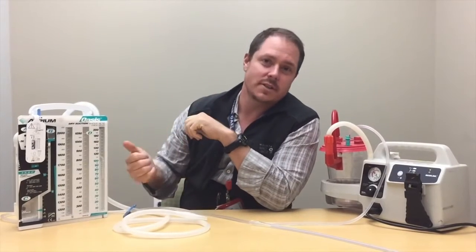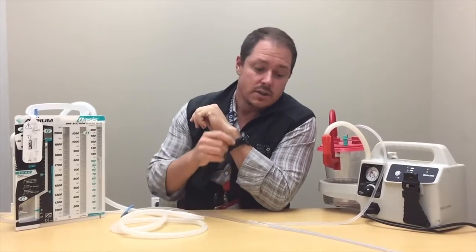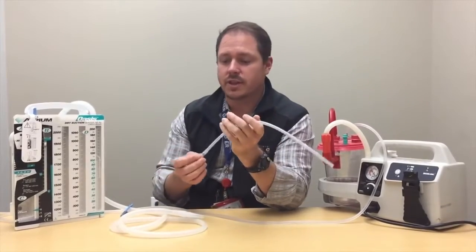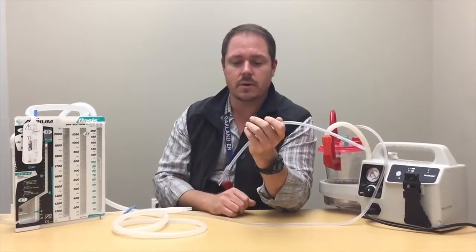This is a quick introduction to the OASIS dry suction system used at Kaiser Oakland and Richmond Emergency Departments. Nurses who don't work in trauma centers aren't necessarily familiar with placement of chest tubes with physician counterparts and setting up the dry suction system, so this is a quick walkthrough for that.